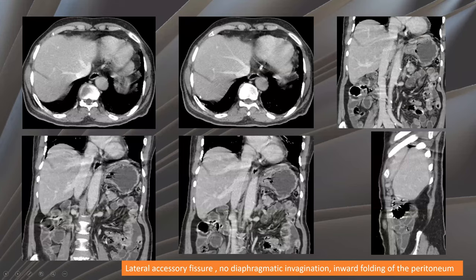Here, this patient has a lateral accessory fissure. Two accessory fissures are due to inward enfolding of the peritoneum into the liver surface.